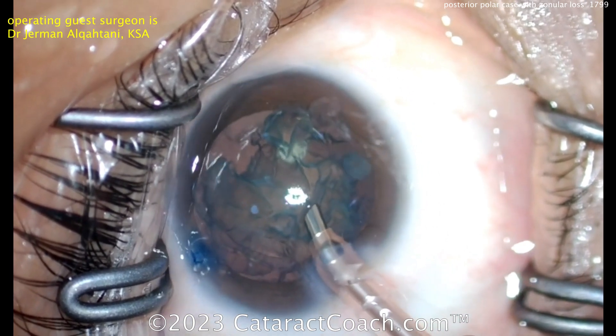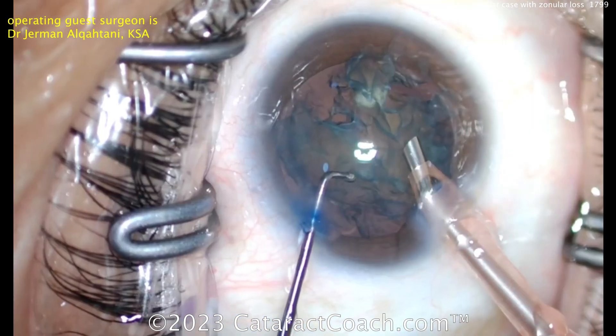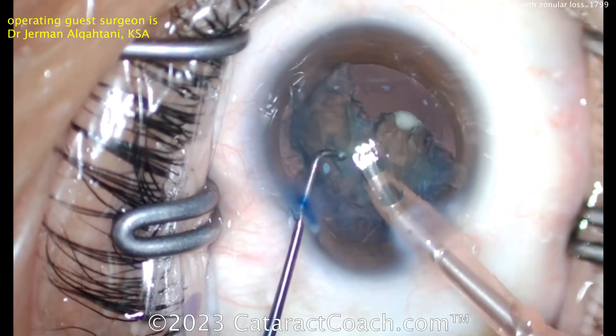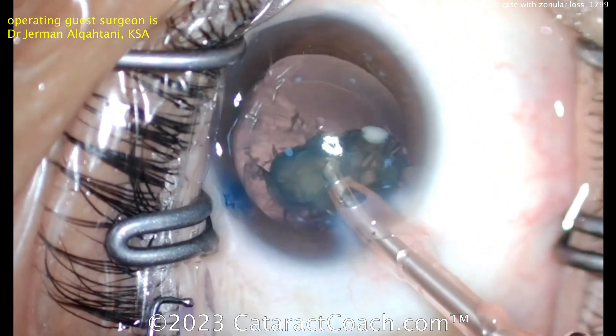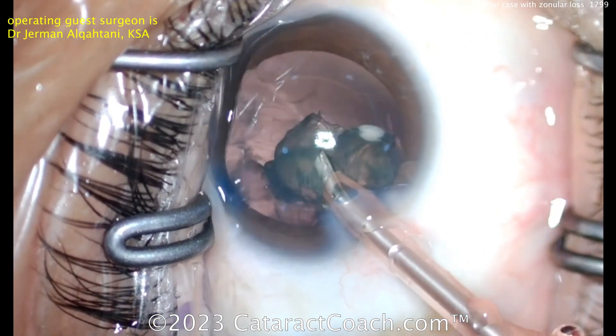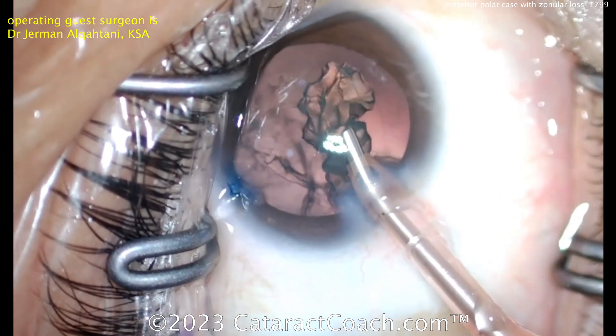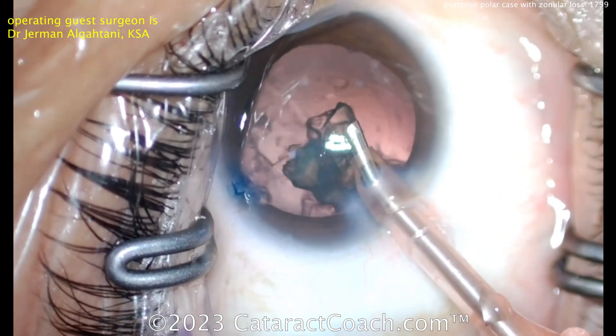Nice and easy, bringing that up. You may want to put some dispersive viscoelastic behind that lens material, slow down your machine settings — nice and easy. Let's see bringing that last piece up. When are we going to see that zonular weakness?